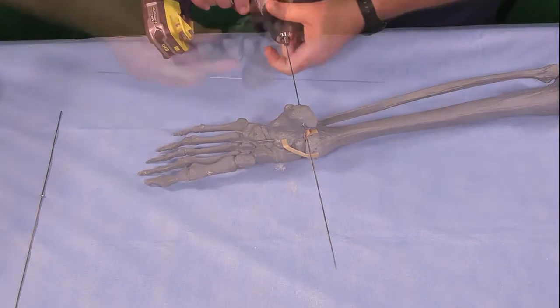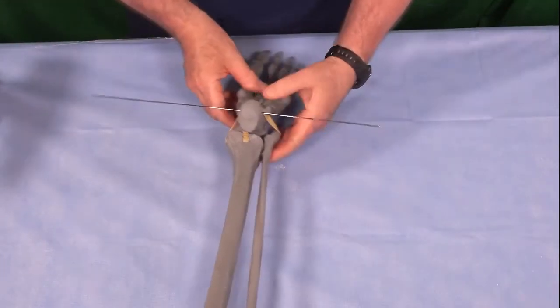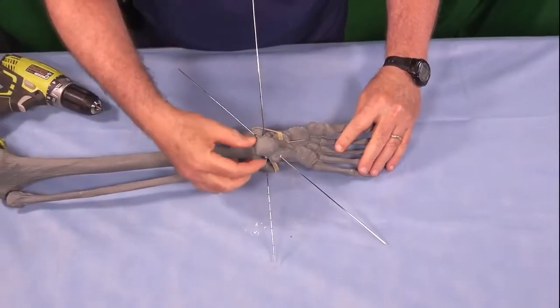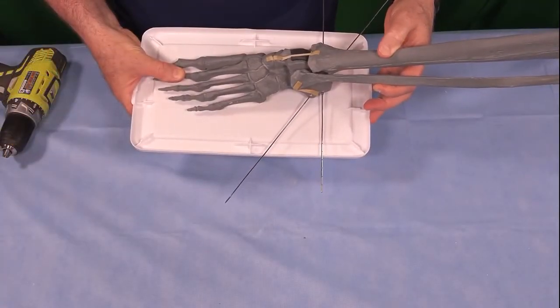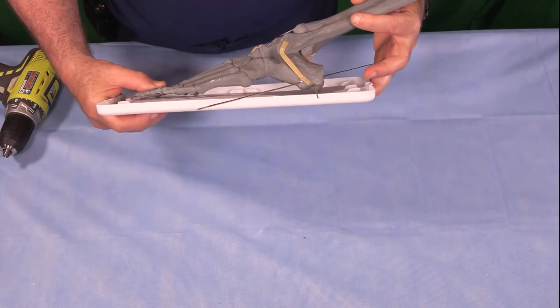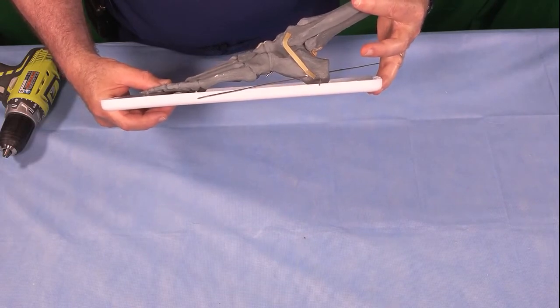I'll take another olive wire. I'm looking for that wire to be parallel to the plantar surface of the foot. The second olive wire will come from the medial side. And now the calcaneus is locked by counteropposed olive wires. I've now placed two counteropposed olive wires on the calcaneus, and I have my cutting board surface to demonstrate the flat surface of the foot, to show you that those wires are more or less parallel to the cutting board surface. And that's going to reflect where our ring is going to go.